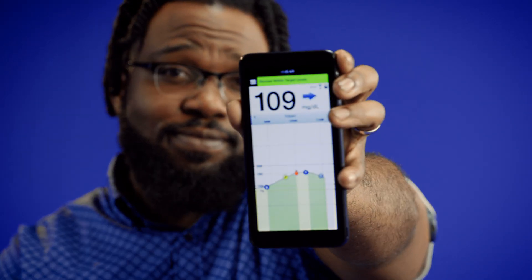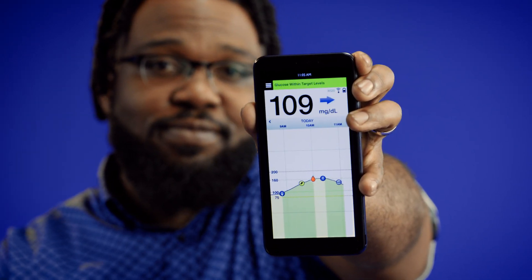The sensor, transmitter, and mobile app connect wirelessly so you can get readings on your phone. After a 24-hour sensor warm-up, you can monitor glucose comfortably and reliably for a year.